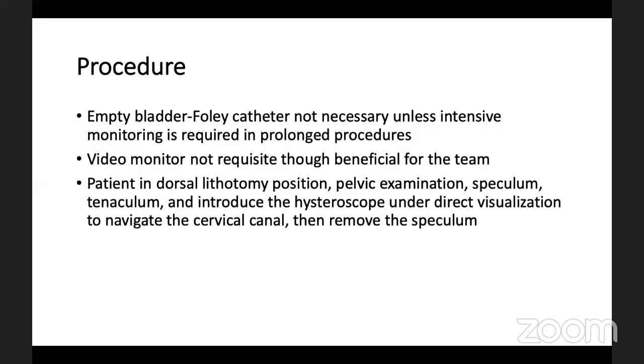Then there's talk of the monitor. The video monitor is not a prerequisite in all the procedures. It's actually just beneficial for the team. The surgeon can just look through if it's just a diagnostic scope without having a video monitor. The patient is put in dorsal lithotomy position. Like I mentioned, you examine the pelvis, put your speculum, and then you can use your tenaculum to stabilize.